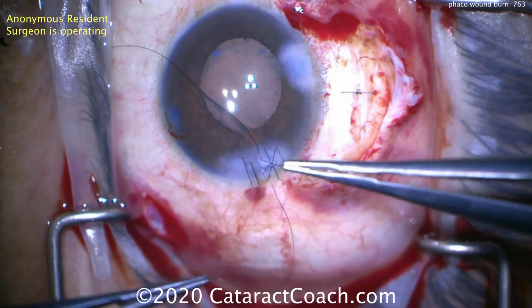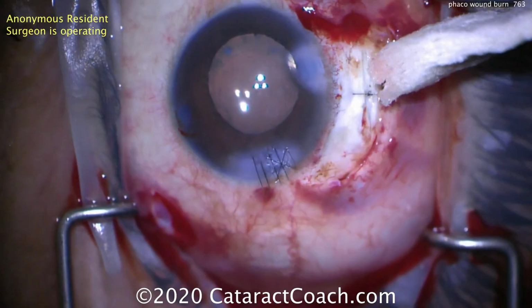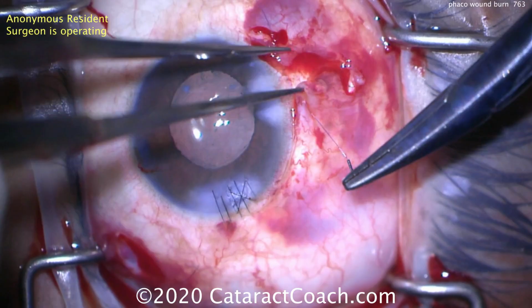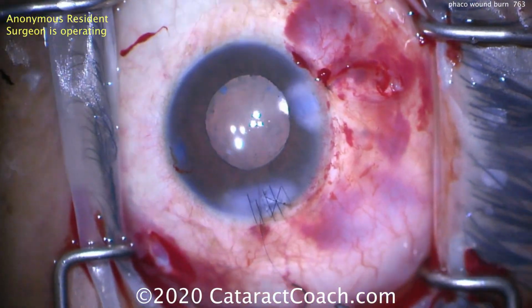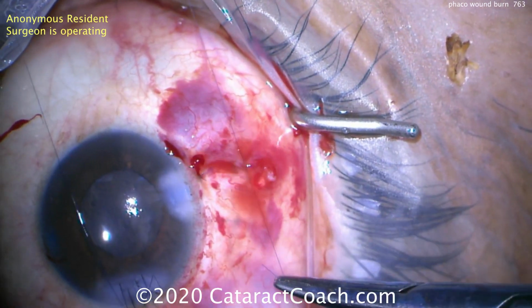The patient was 20/40 vision the next day, and we'll watch the patient over the next couple months to see the healing here. Don't take these sutures out of the cornea too early. You may need to leave them in there for a prolonged period of time. And you can see we made another incision there. Once we saw the phaco wound burn, we made another incision superiorly, a scleral tunnel, and finished the case that way.